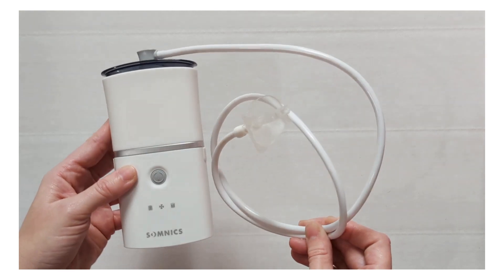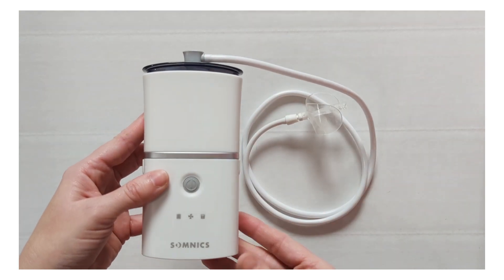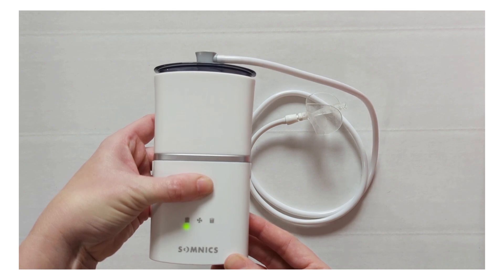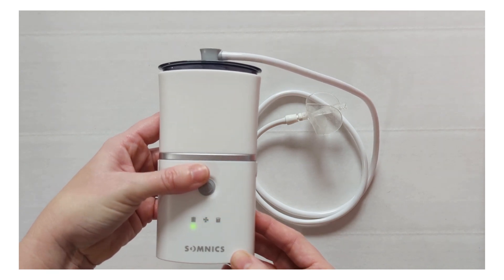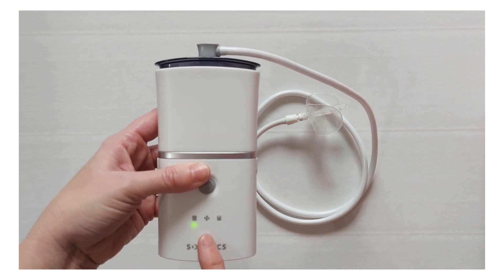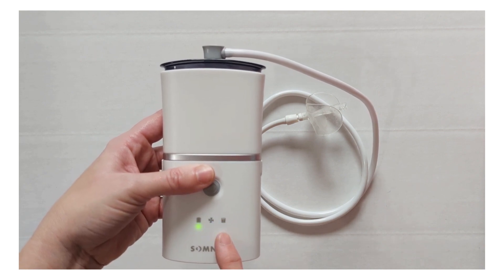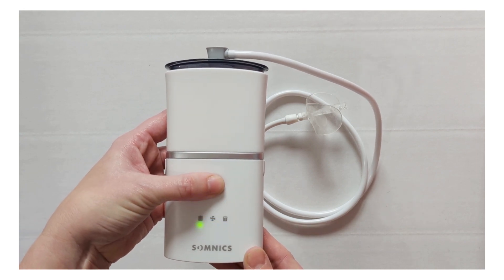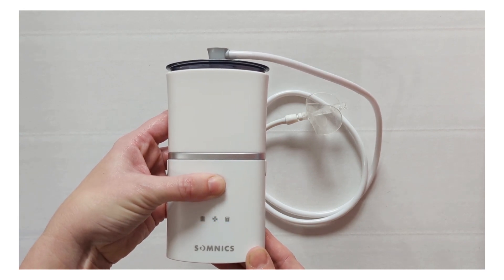Now your device is ready for usage. To power on, hold down the power button for three seconds until you see all three lights flash. Your green light will be steady, the blue light will flash, and the orange light will go off. To power down, hold it down until all lights go off.